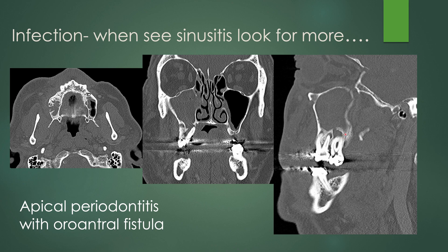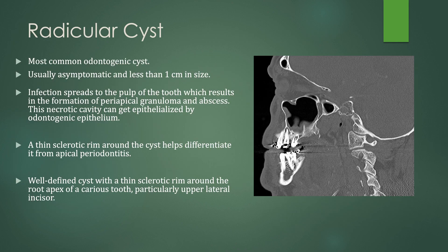So when you have this connection in the bone, this is called an oroantral fistula. When I see these, I measure the size of the fistula on all of the planes of imaging and describe which tooth it is related to.